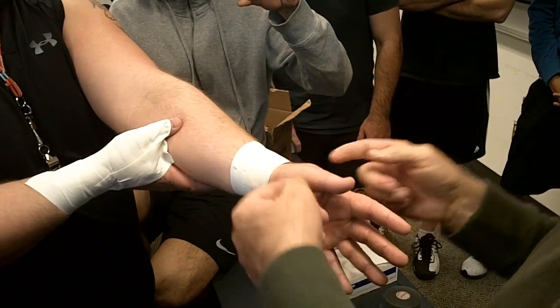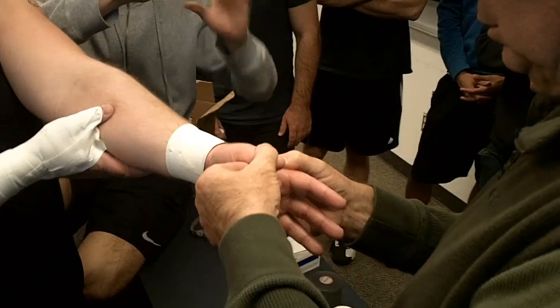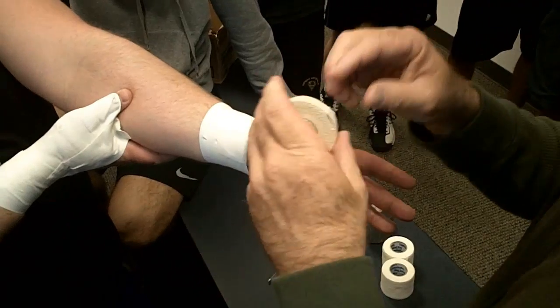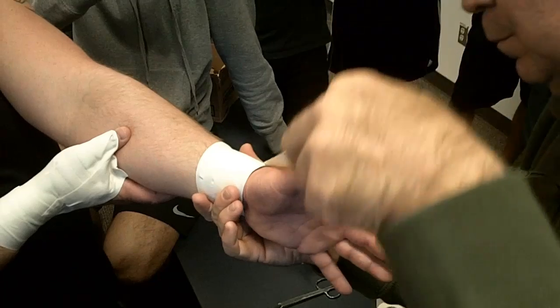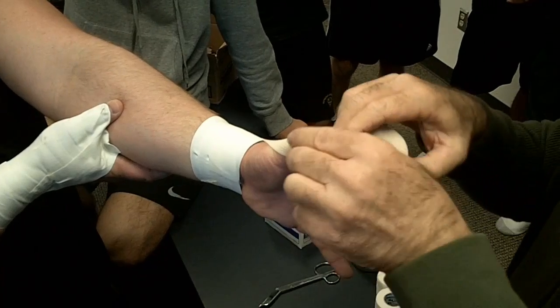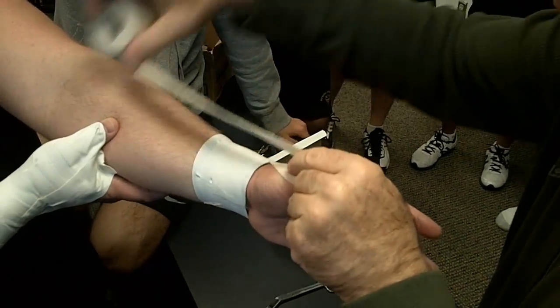So it hurts to go into flexion. Still got to get out to the interphalangeal joint. Out. So back up. There we go. Hold it right there. We'll even let you bend it just like that. I want to come out, I want to take the stretch out to here. I pin it and I relax the tape around the thumb. Then I can just pinch it again.